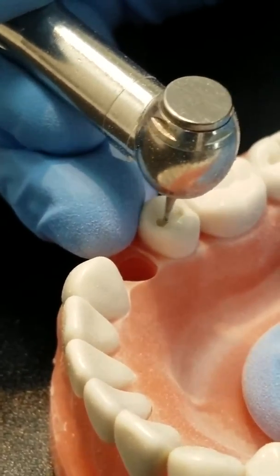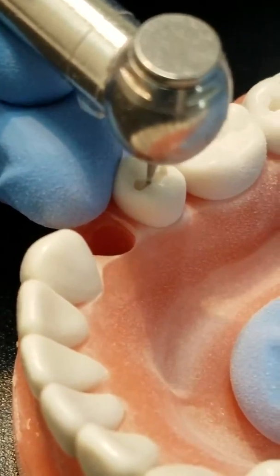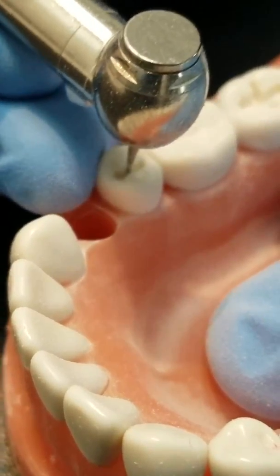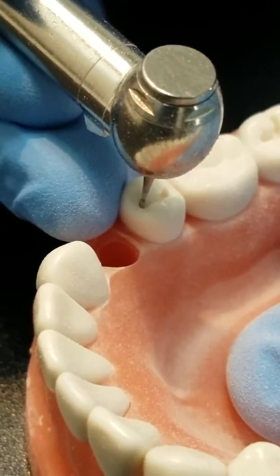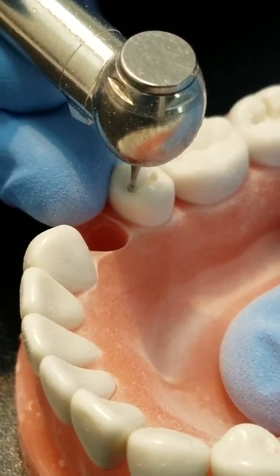Here you'll see me switch to the distal and mesial walls and angle the bur a little bit so I can get the diverging walls. You can hear the bur slow down as I'm touching the walls, but since I'm going so slow on the pedal it doesn't take out a chunk — it just stops.